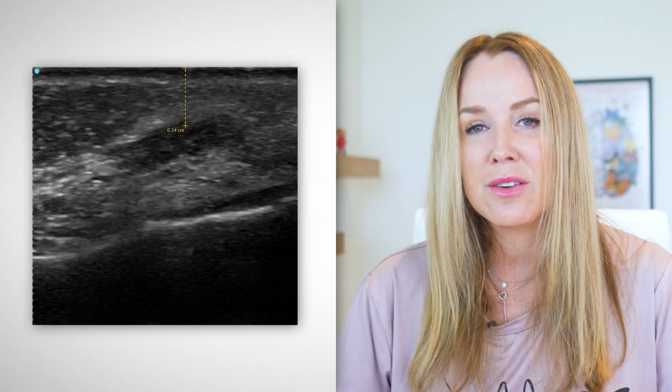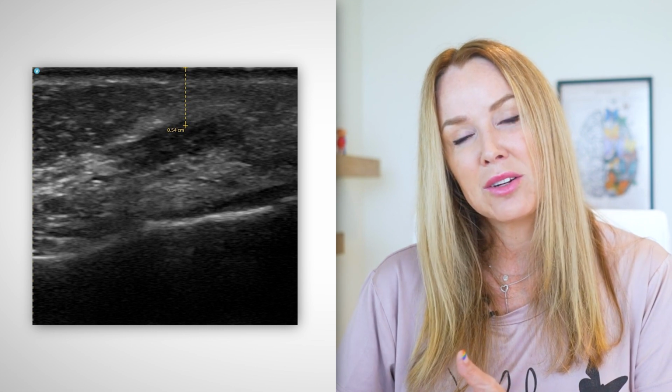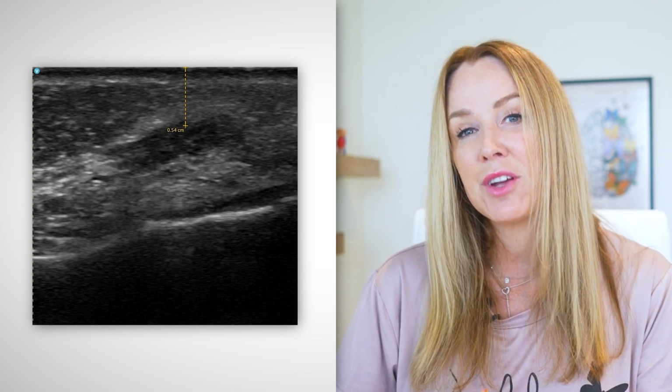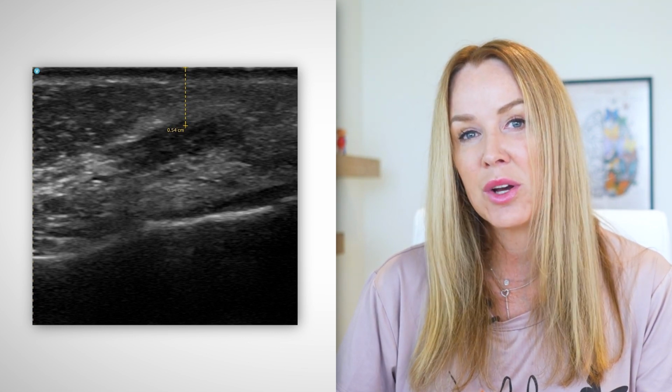So the image of this ultrasound of the DAO was taken 1 centimeter laterally to the oral commissure and 1 centimeter inferior to the oral commissure, just beneath the modiolus. Now that you've seen this picture, would you treat the DAO any differently?